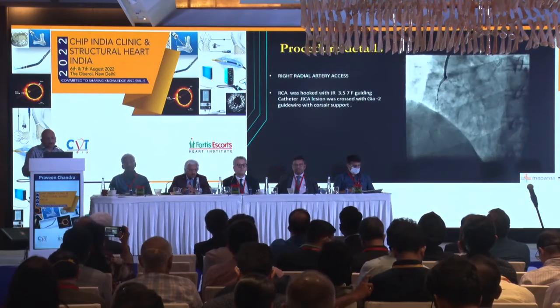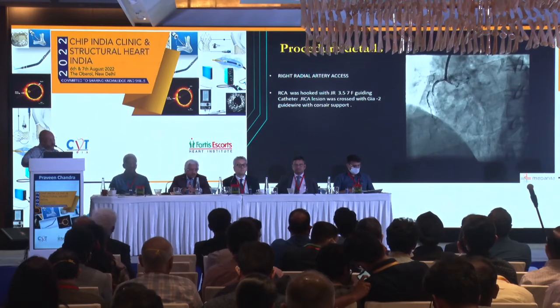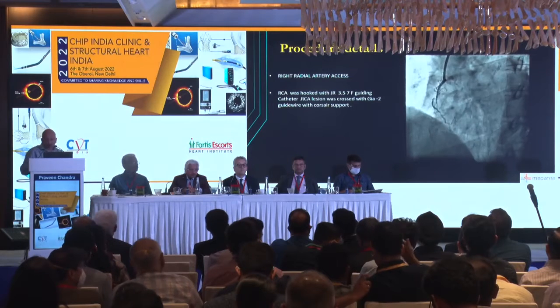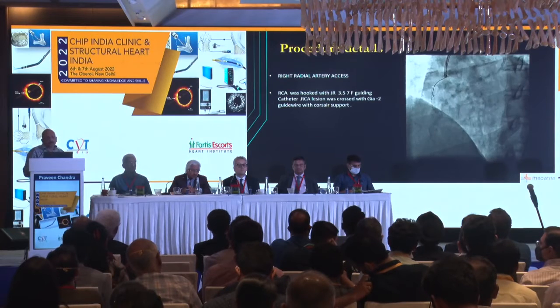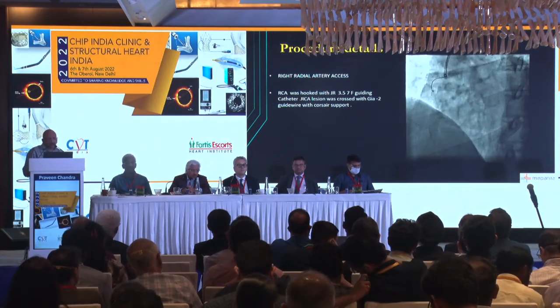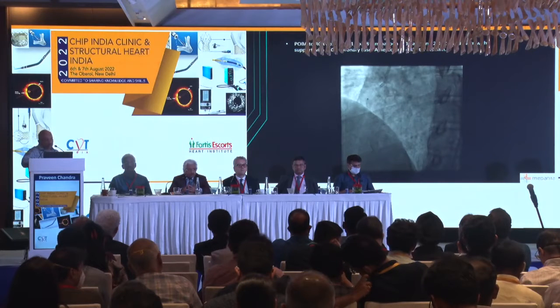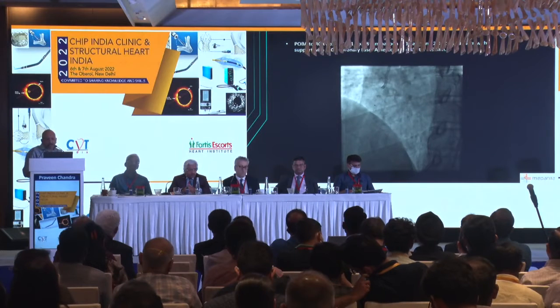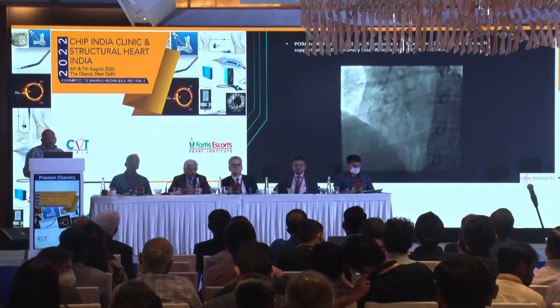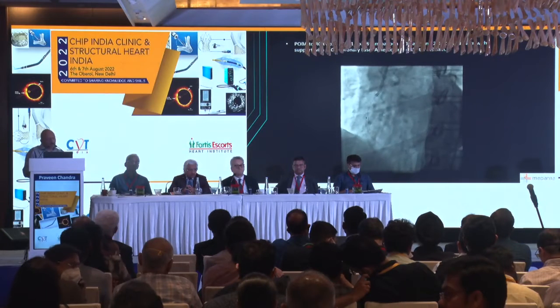this time again, he had a total occlusion of the right artery. There were 2 stents which were already there in the right artery. It was total occlusion. It was a Gaia 2 wire which we could finally cross. And after that, we did a laser because none of the balloons was crossing. So we did a laser here with a 0.9 catheter with, I think, fluence of 60 and rate of about 60 also because it was very tight.